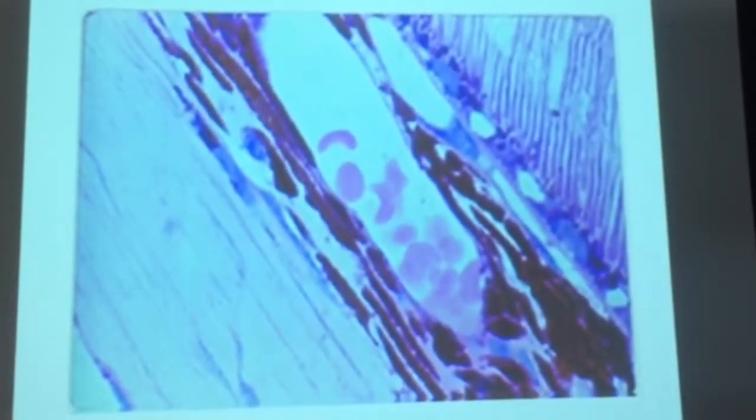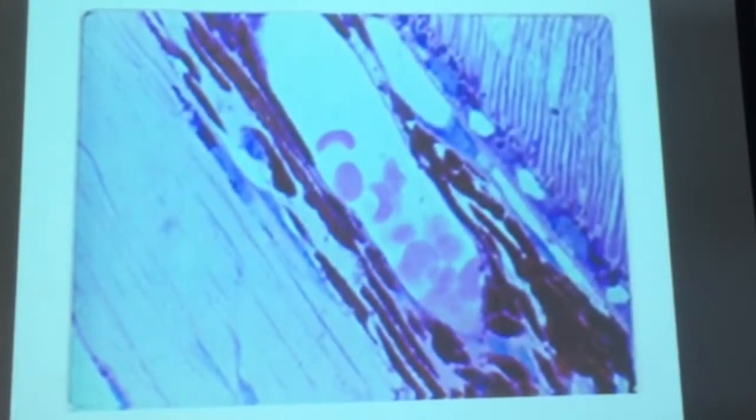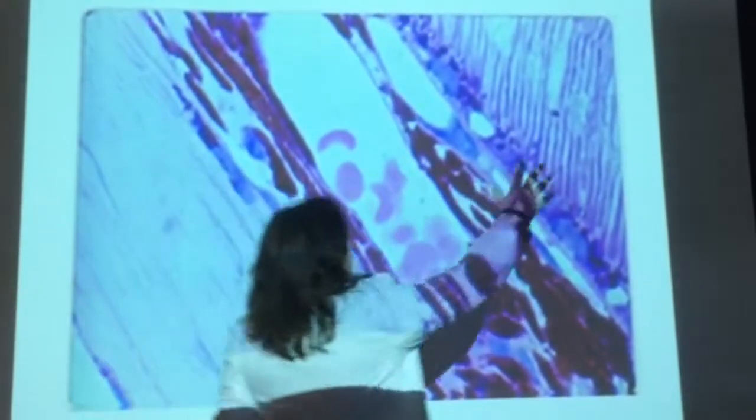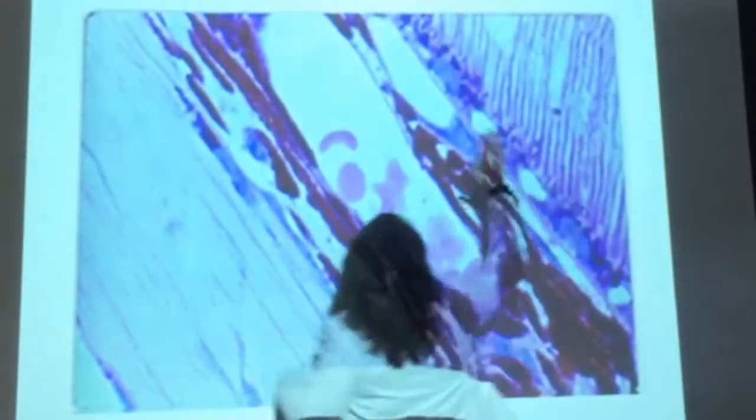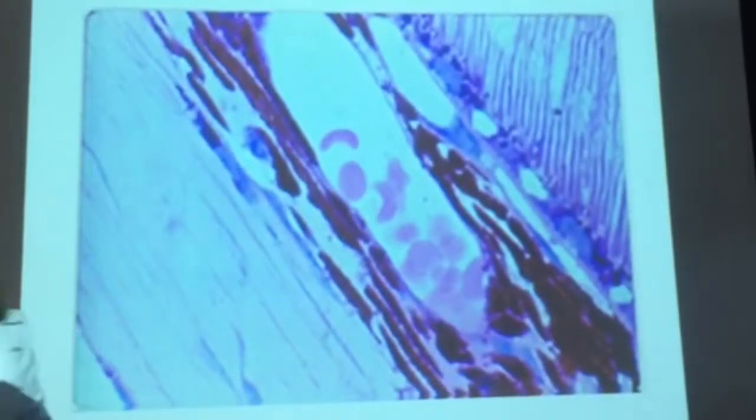Remember we did rocks. So we start from the inside and work your way out to get rocks. So start from right here. This is your retina. This is your choroid with the blood vessel here. And then S is for sclera.